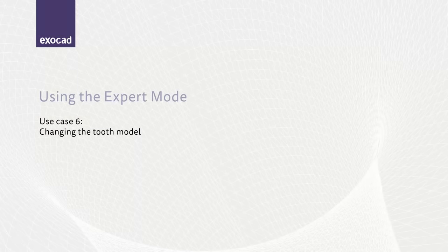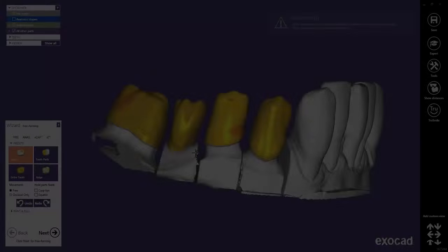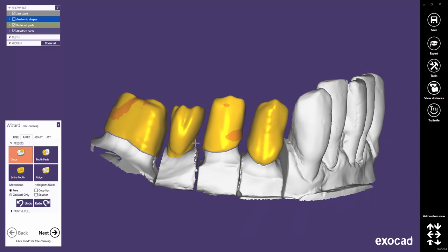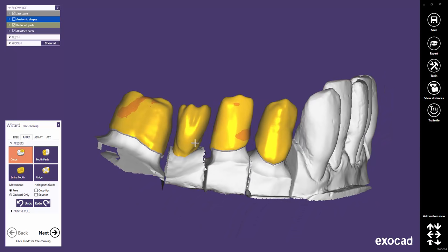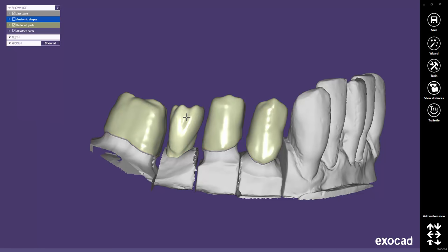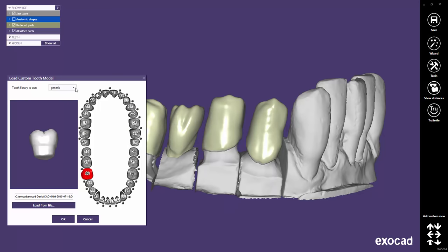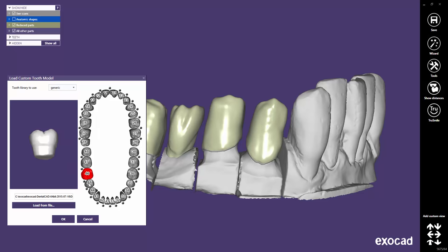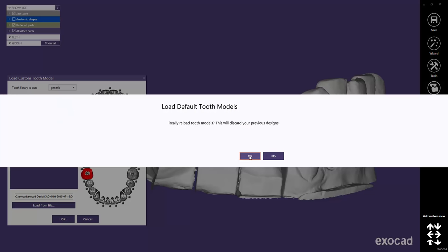In the last sample case, I will show you how to change a tooth shape when most of the job is already done. Imagine you are in the free-forming step and you discover that there is not enough space for a molar tooth. You decide to change it into a premolar. Switch to the expert mode and right-click on the tooth you want to change. Click on Load Custom Tooth Model. You might even change the tooth library now. Click on the tooth you would like to select for this tooth.